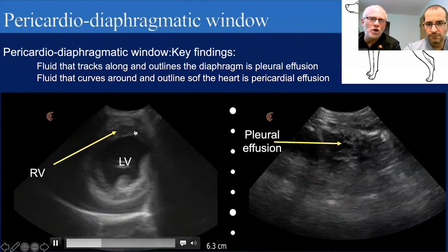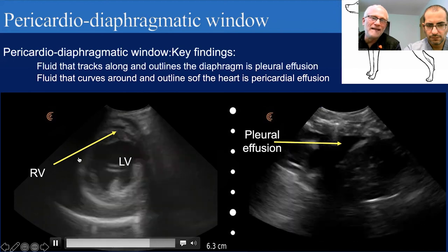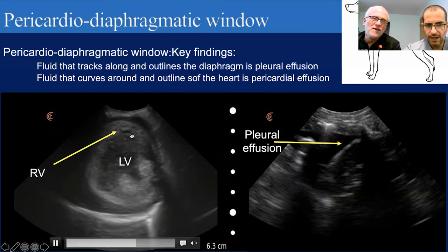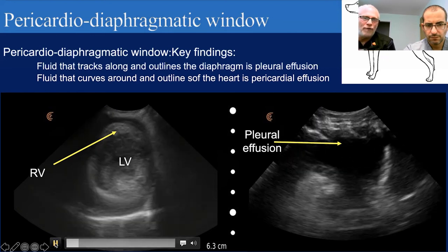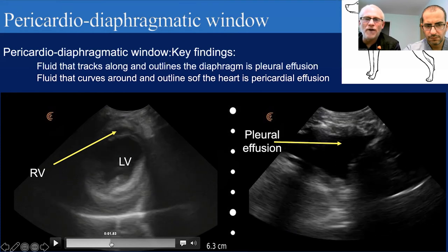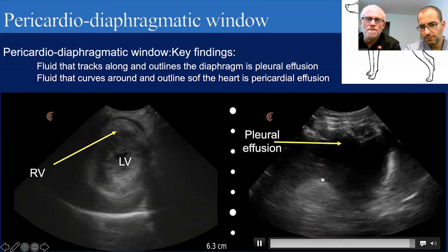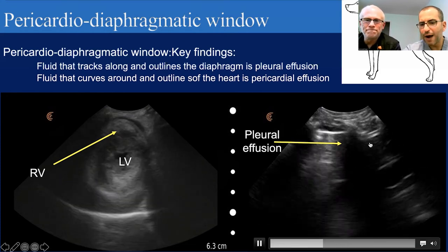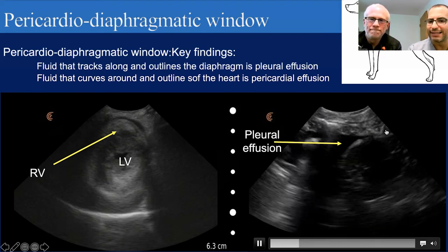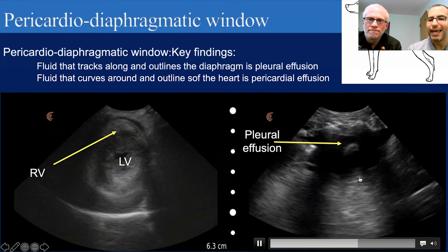That pericardial effusion curves away from the diaphragm. In this example, we still see the mediastinal triangle of fat as well, right there, exactly. So we see those same structures, and now the fluid curves away from and preserves the mediastinal triangle and away from the diaphragm. On pleural effusion to the right, Dr. Chalhoub, what happens? The fluid will track up and down the diaphragm, Dr. Boysen, really go to all the nooks and crannies there, so it outlines the diaphragm and not the heart this time.